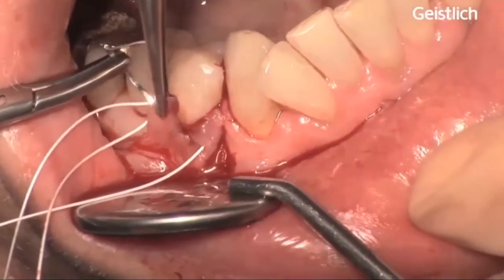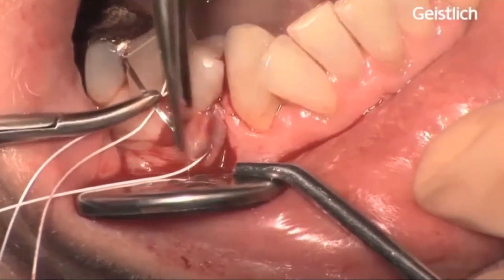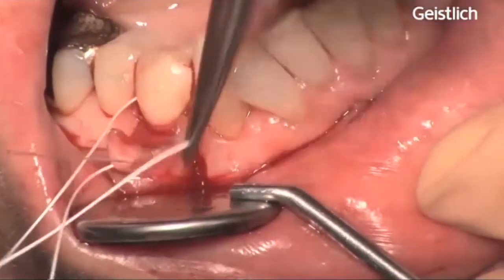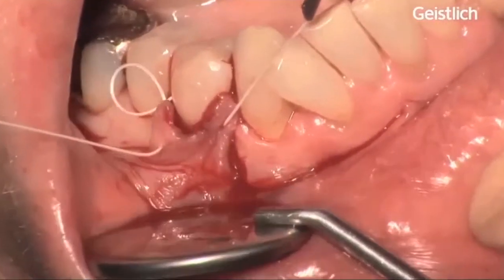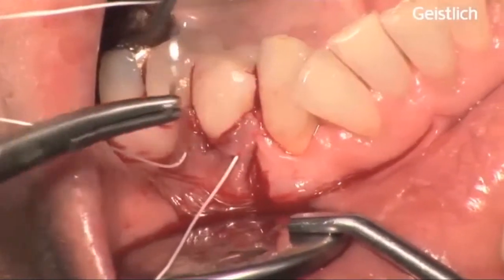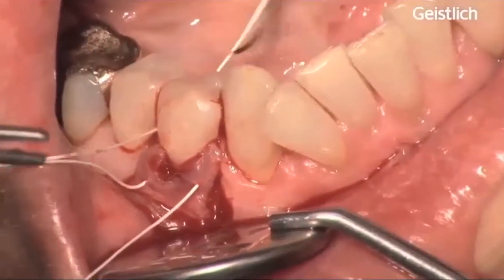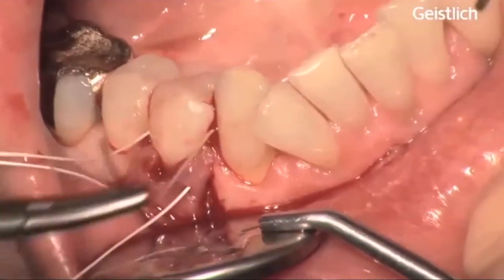Vertical incisions are closed by interrupted periosteal 6-0 sutures, starting at the most apical extension of the vertical release incisions. Suturing proceeds coronally with interrupted sutures, each of them directed from the flap to the adjacent buccal soft tissue in the apical-coronal direction. This is done to facilitate the coronal displacement of the flap and to reduce tension.